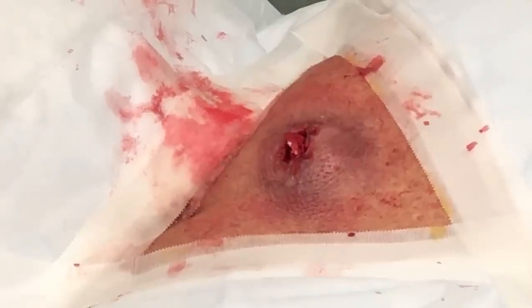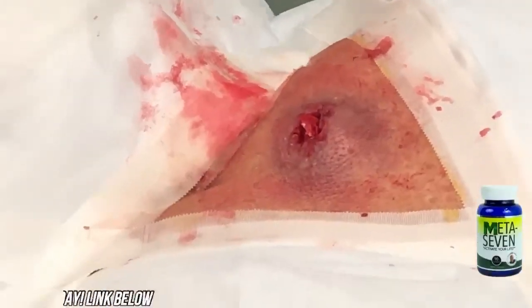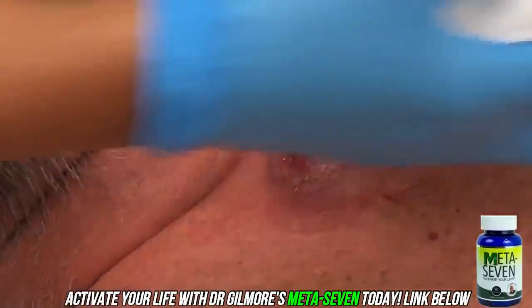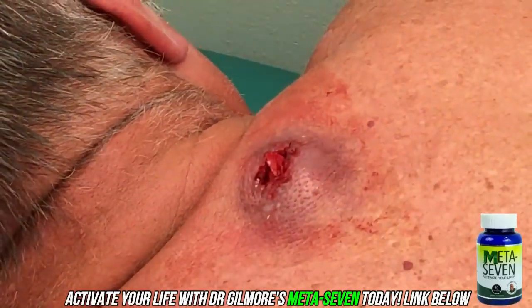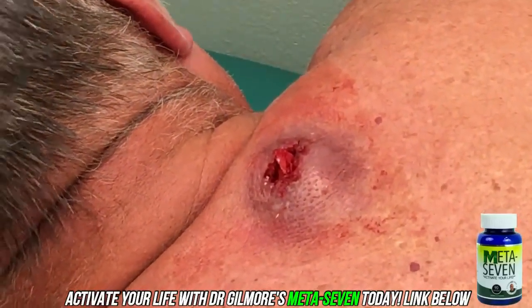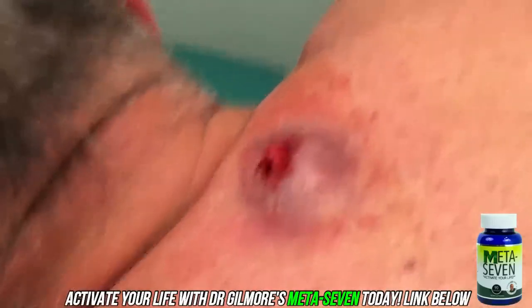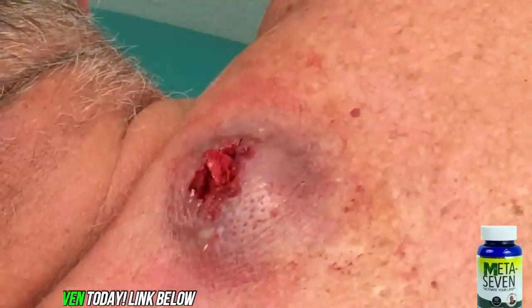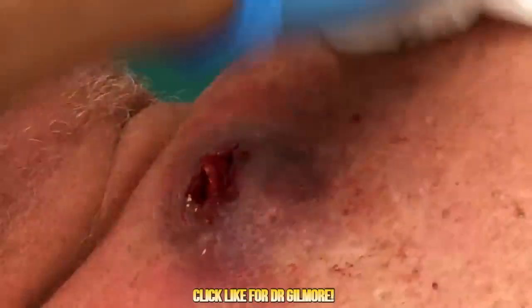You want to take it from there? Yes. All right. Oops, stay real still for me. Stay real still. Okay. There we go. All right. So I'm going to need you to come back tomorrow. We'll remove the packing and we'll repack that for you, okay? Okay. We appreciate you letting us video this for our fans on YouTube and Facebook and all over the place. And we will see you tomorrow for an update, okay?